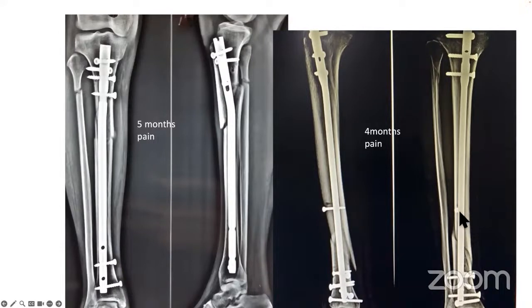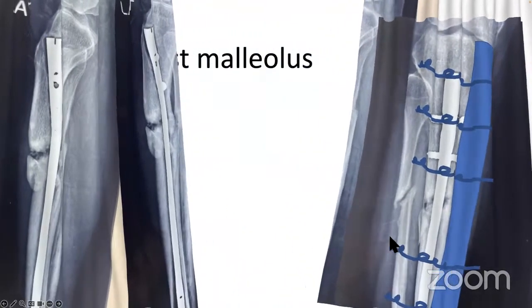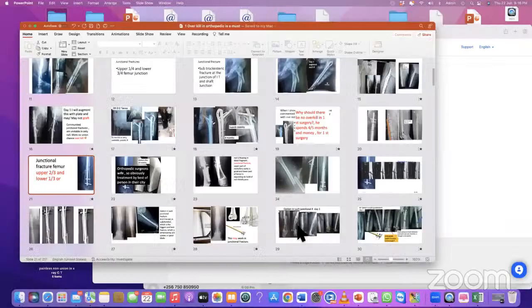So it's very simple, I feel, to put in an adjuvant plate. And that is a big insurance, so that you will not go through this just because you have put in 4 screws here. Such a fracture, you put in a nail, proximal femur junctional fractures, possibility of a non-union, which occurred. On day one, nail and a plate would have solved the problem.